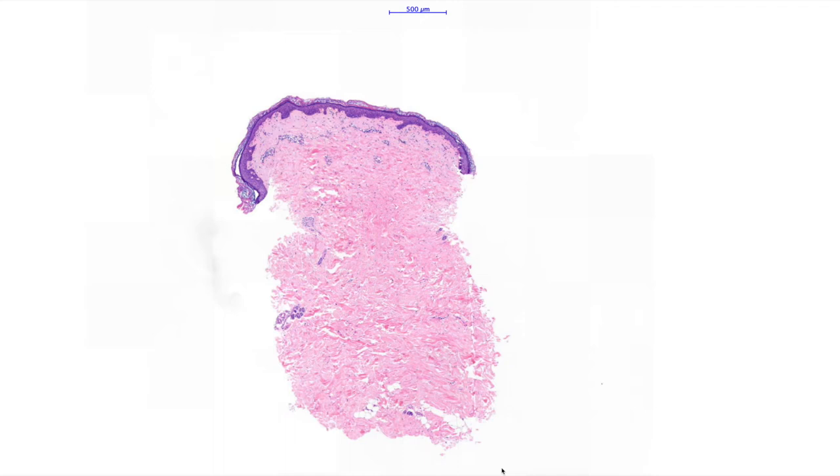Hi everybody. This is an example of pityriasis or tinea versicolor, which is a type of superficial cutaneous fungal infection. This biopsy was taken from a one to two centimetre plaque from the abdomen of a young adult, which was slightly hyperpigmented. The clinician wondered whether it might have been a kind of flat seborrheic wart and so took this punch biopsy from it.